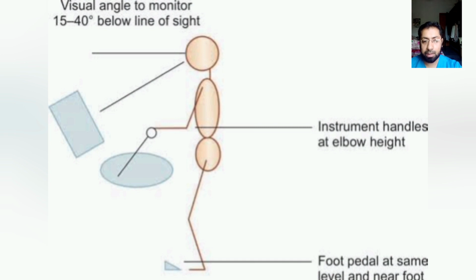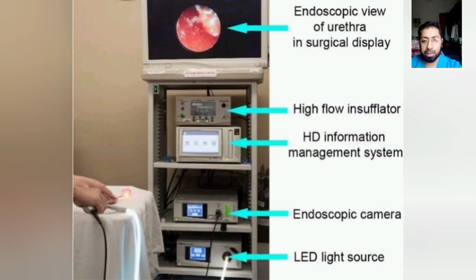Now another is sectorization. When the optical trocar is placed in one of the lateral ports, it is termed sectorization. In fact, these sectorizations are made because of another term labeled as handling instrument. Sectorization of instruments should be avoided by beginners, since it requires a greater degree of understanding and experience of the laparoscopic view and significantly different hand-eye coordination.